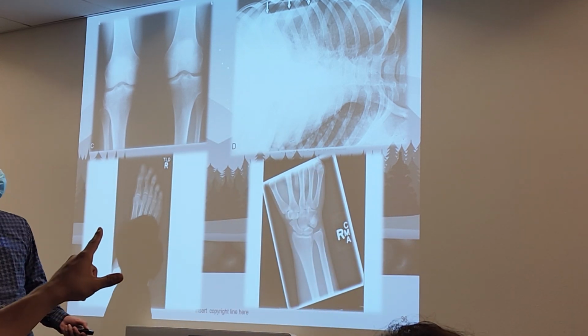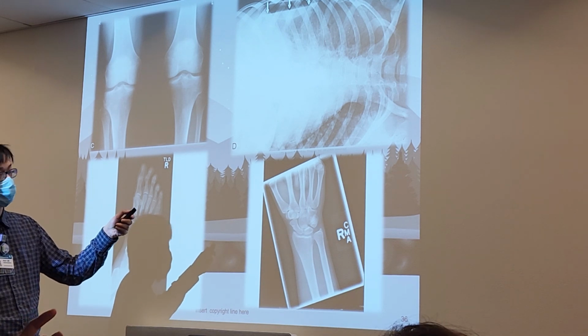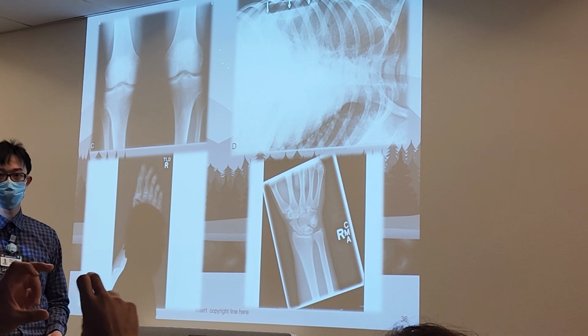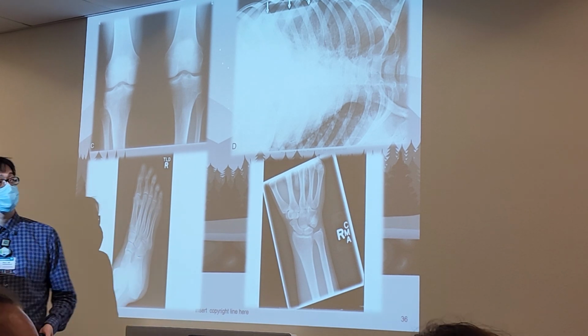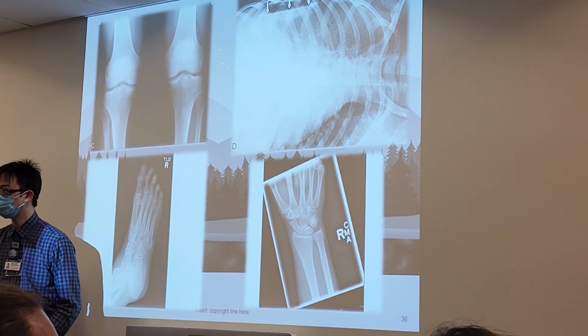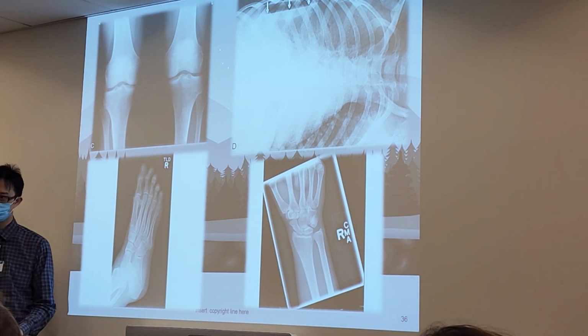So if that top right one was done with your BBs, we would be able to see that it had the BBs towards this and it was oriented this way? Correct. Okay, cool. And sir, those two don't have initials, those pictures? Yes. If you don't see initials, it's very likely it was a digital marker. Oh. So that's the other problem with digital markers. They don't come with initials. You would also need to digitally mark your initials.